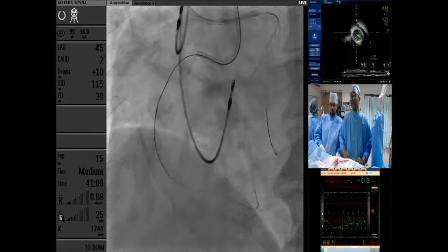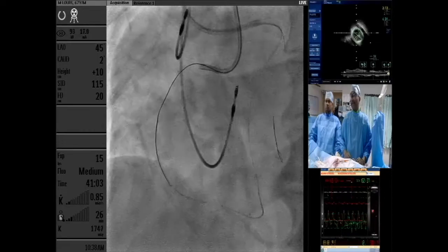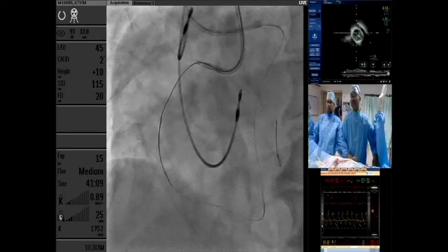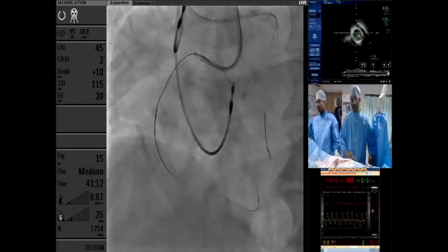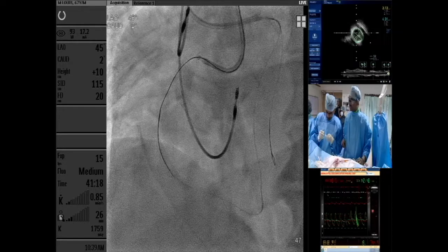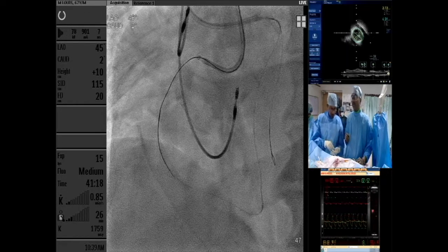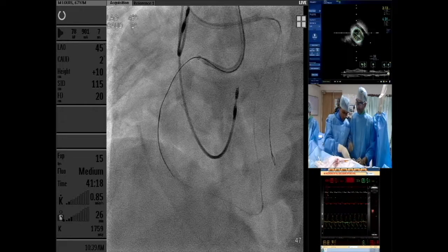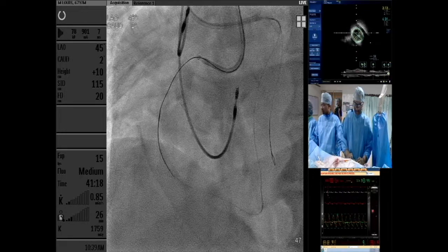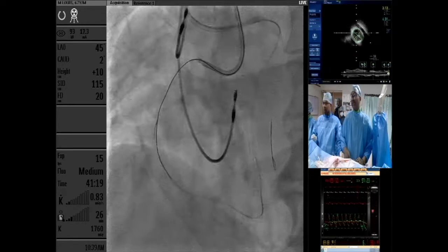We are not really bothered about it. Yeah, give me 1 mm balloon, please. So we positioned the guideliner into the RCA, but see, the lesion was definitely significant. So 7 French guideliner may not go down. I'll try to go with the 1 mm balloon down. If it goes, it's fine. If it doesn't go, then we'll take a 2.5 balloon. We'll dilate proximal RCA and we'll deep dive with guideliner into RCA, and then we'll take further steps.